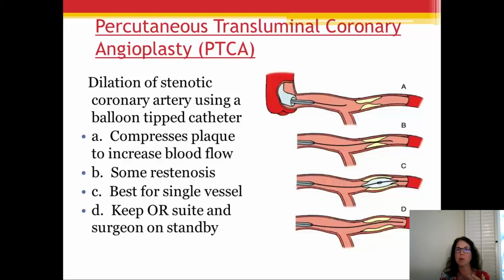So now you'll see it's even more popular if you're going to balloon and stent at the same time. Better outcomes than just fibrinolytic therapy alone. It's a regular cath. Typically you go through the groin and you follow it afterwards to make sure they don't reocclude.